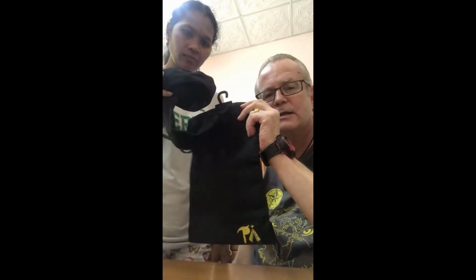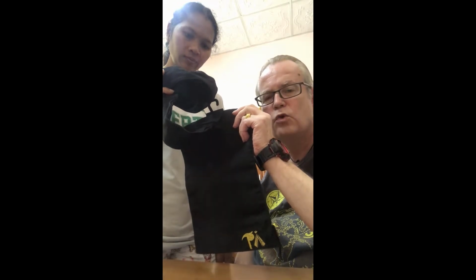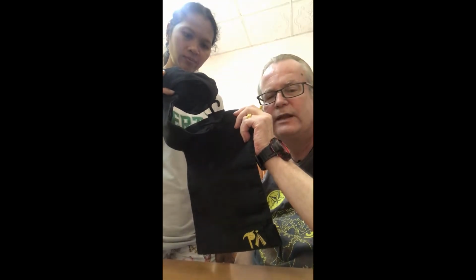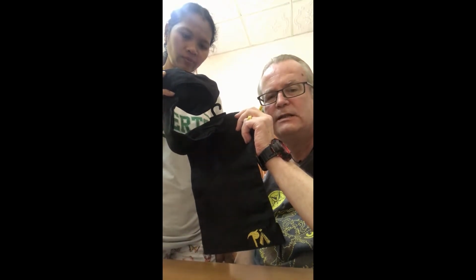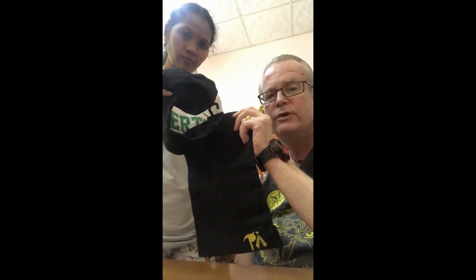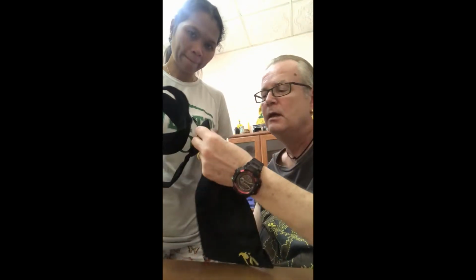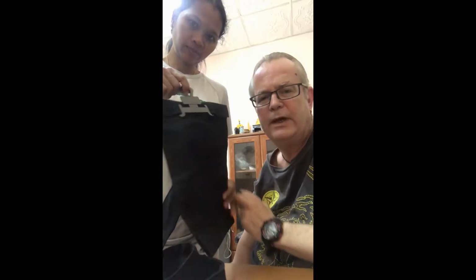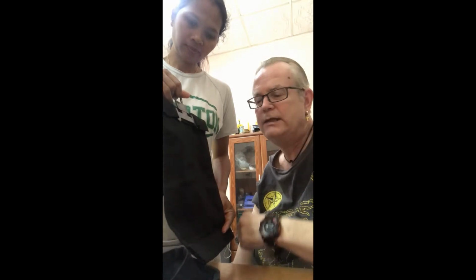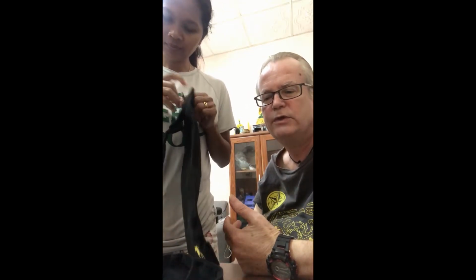Now, this bag is 11 inches tall and the width is 8, so it covers nicely a 2,000 milliliter bag. So May will quickly put a 2,000 milliliter bag into this to show you. You can make bigger bags if you like. The whole idea for me was I wanted it to be reasonably unintrusive.